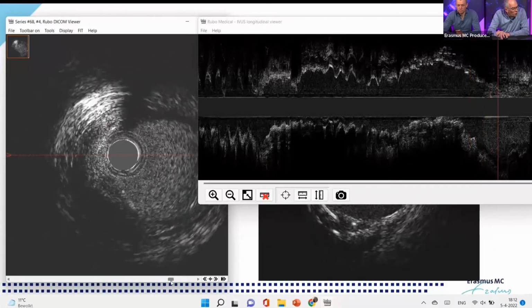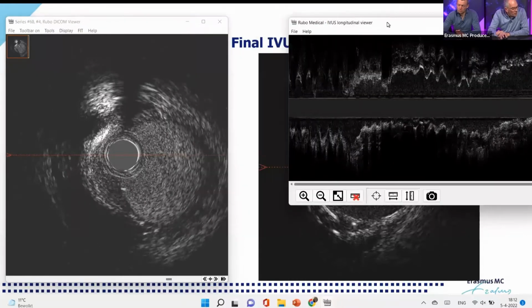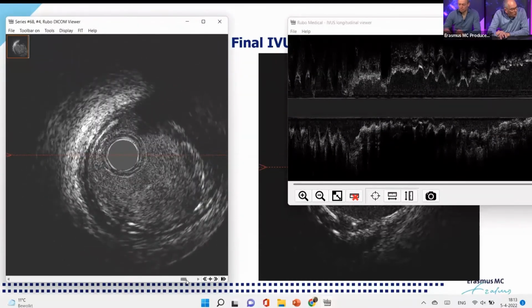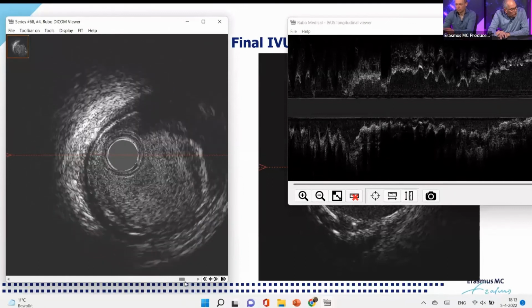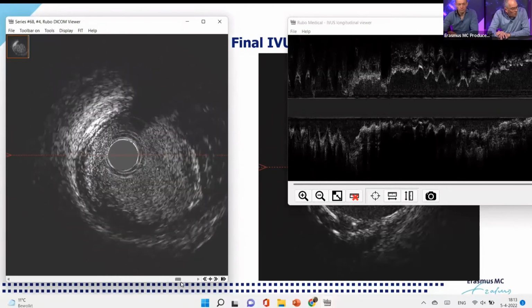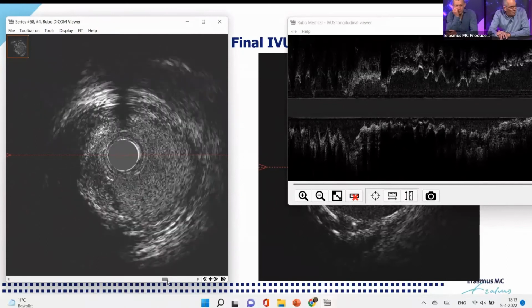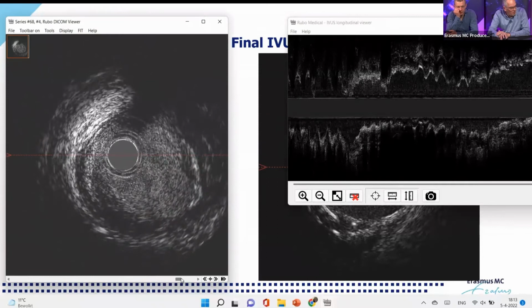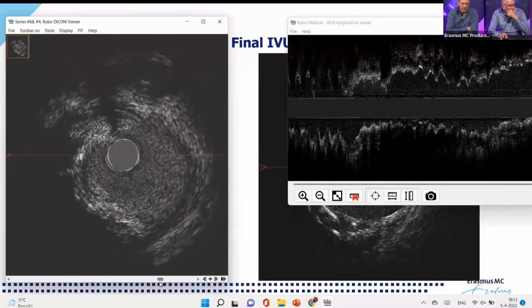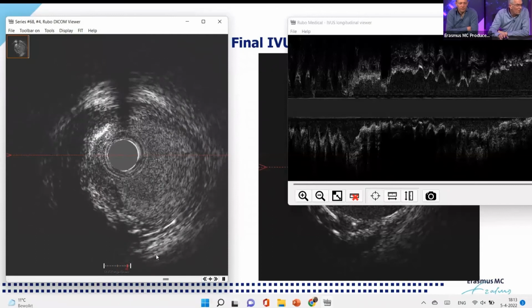And then of course we saw the hematoma. It's in here. And we have here a smaller lumen proximal, and we knew already that we have a plaque burden of 60%. So there's not really a big change. No. So we didn't extend the dissection. There's no clear hematoma. There's a very small rim just here at 6 o'clock maybe, but I think that is really for the expert reviewer's eye.